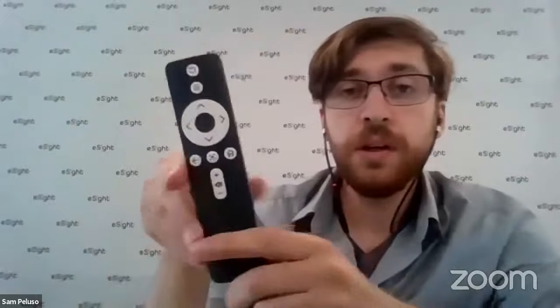Excellent. Why don't you tell us a little bit about how you control the device? Yeah, of course. So the device comes with this remote. It's very small. Your TV remote might be larger, and it's connected with Bluetooth to the eSight device. And with this, we can manage all the controls. We can zoom in and out. We can adjust contrast. There are binary color filters like black and white, color inversions, blue, yellow, that sort of thing, if that helps you with reading. You can take videos and things like that. That's all with the controller.